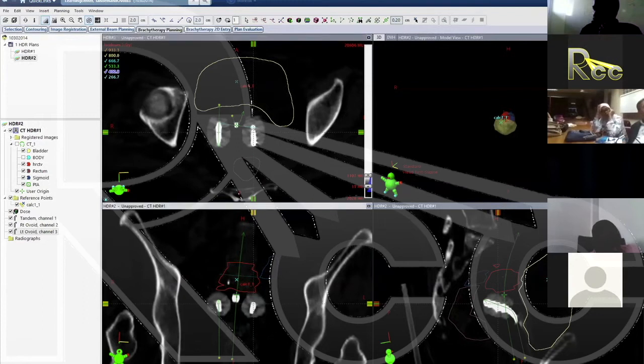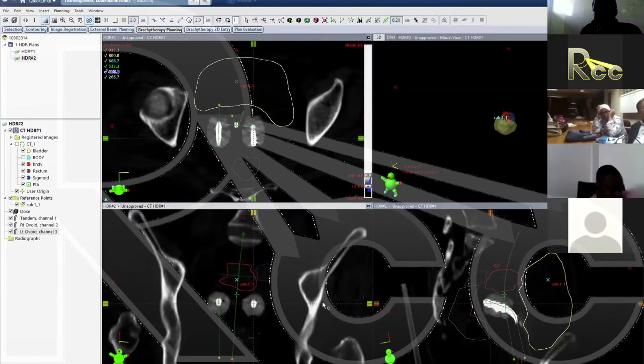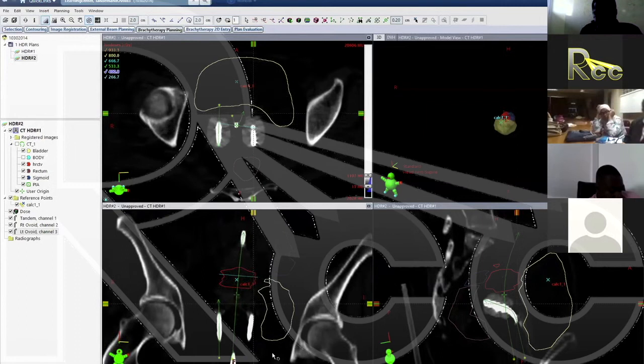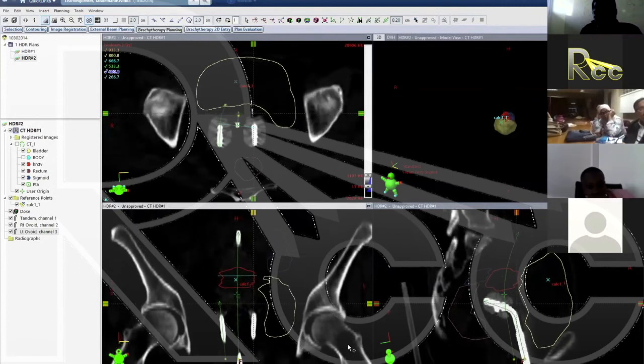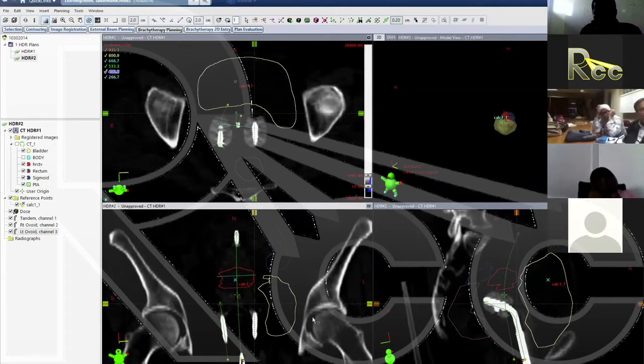Now we're going to move to the bottom left image, and I'll scroll through that. I like it at the tip of the ovoid, but when we come up here, I have a feeling there's a bit of a rotation. So see here, it comes away from that vertical viewing line. So again, I'll just have a counterclockwise rotation, set that back to the center, maybe a little bit more. Put that viewing plane in the center, and then I'm going to go ahead and scroll through the bottom left image.